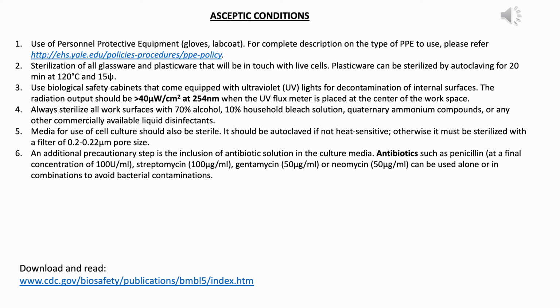Despite all of these things, cell cultures frequently undergo contamination either with bacteria or fungus if any of these conditions are not met. And so it is very important that these are always there. Despite following all these aseptic conditions, one still sees contaminations. That contamination can happen only if any of the aseptic conditions are not followed, because that is the only way through which bacteria or fungus can enter inside your cell cultures. So if you find contamination, then most likely you have certainly been relaxed in one or other steps in the aseptic techniques. Now, why are contaminations dangerous?